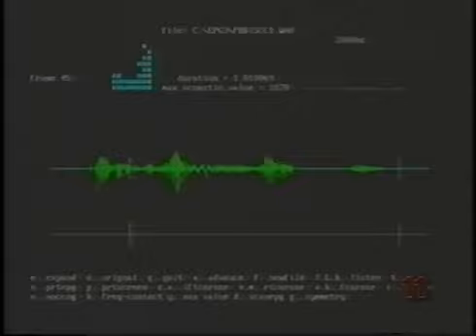The cursor is now placed during the bilabial stop in the word biscuit. In a normal speaker, there would be minimal tongue-palate contact here, but Peter shows evidence of complete velar closure. The cursor is now placed during the final alveolar closure in the word biscuit. Note the abnormal double alveolar velar articulation. These double articulations were not obvious from the auditory analysis.